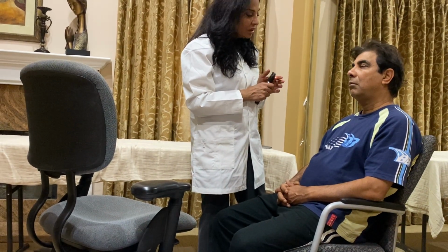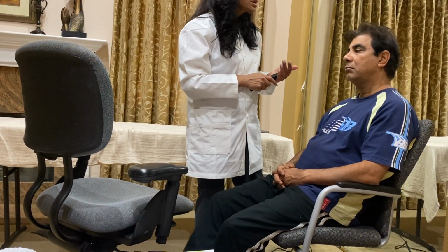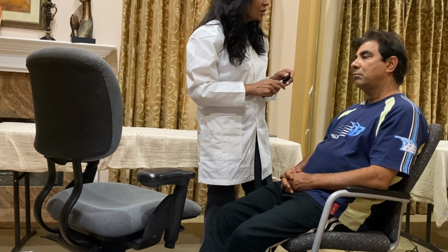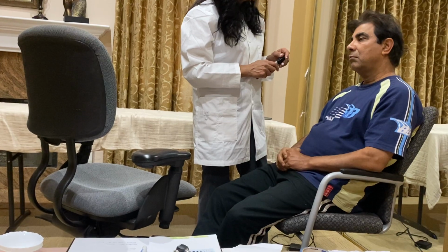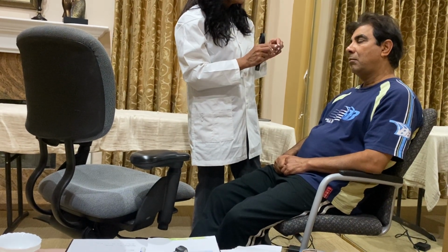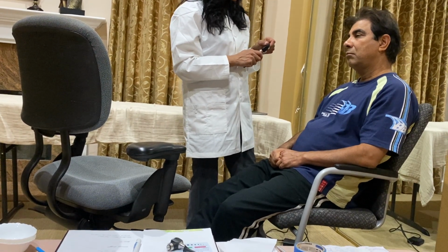which was oval. I was able to see the optic cup, which was round. The disc and cup ratio was 0.3. The blood vessels were narrow, and there were no tortuous blood vessels. There's no papilledema seen. I also saw no AV nicking. I don't see any cotton wool spots anywhere. I do not see any pigmentation on the retina, which is normal.